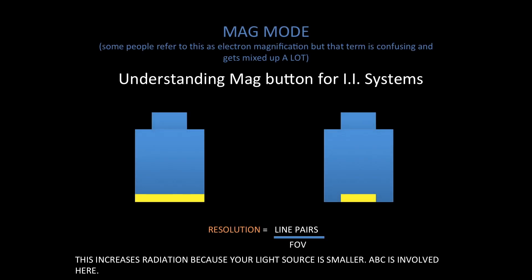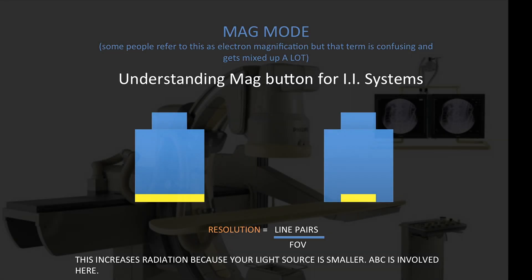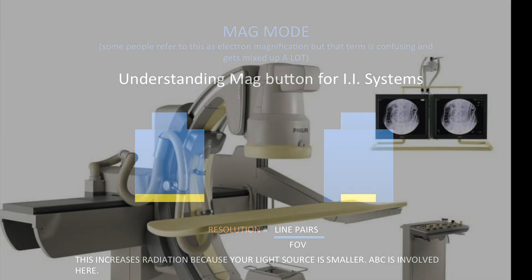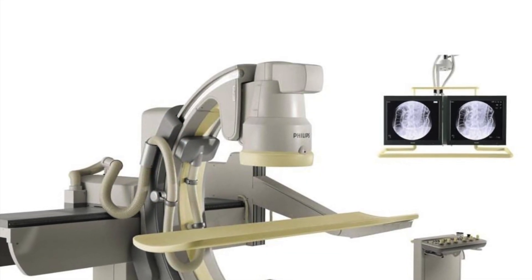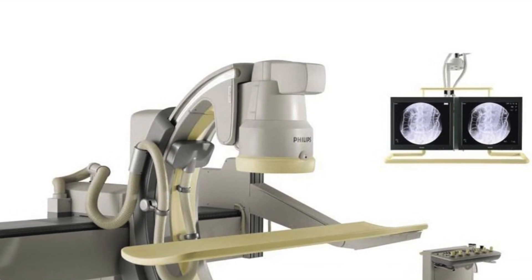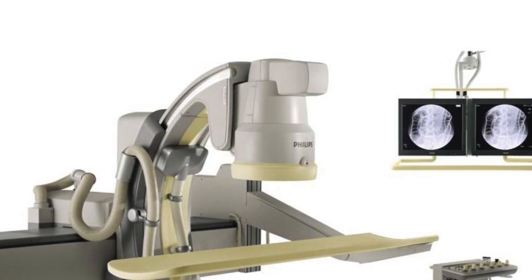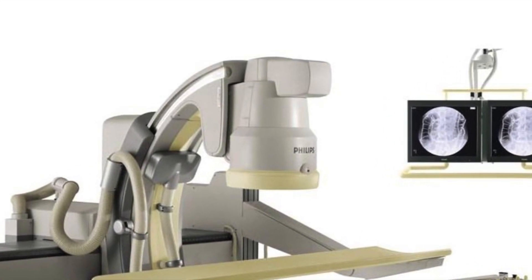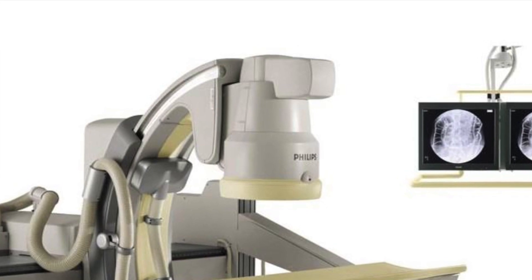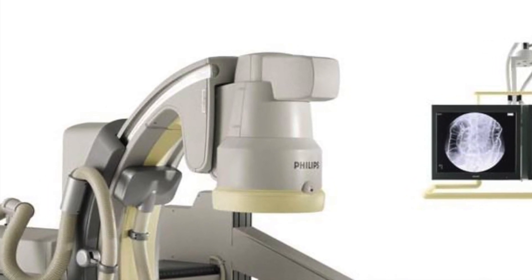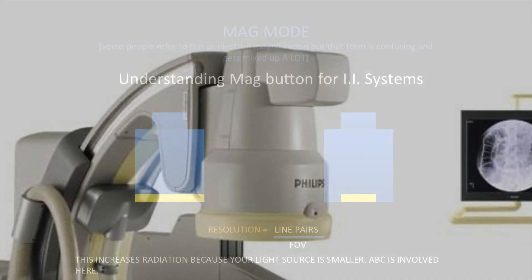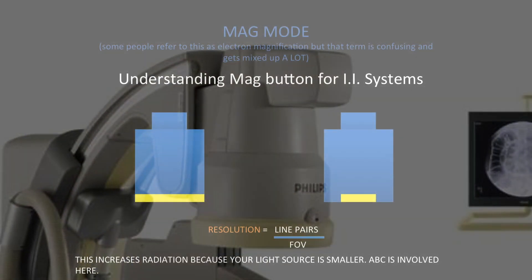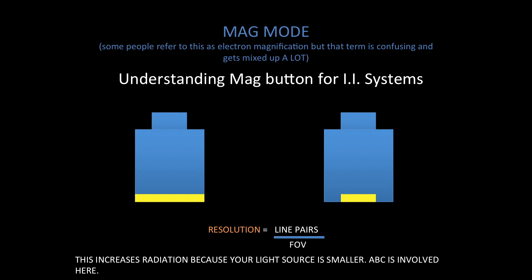Hello everyone. This is a short explanation of the magnification mode, specifically when we're talking about I.I. systems. I.I. stands for image intensifying systems.